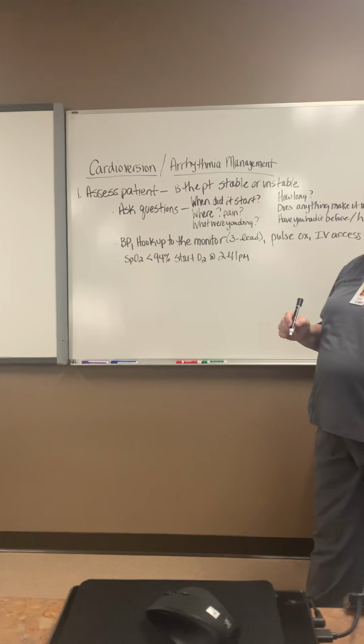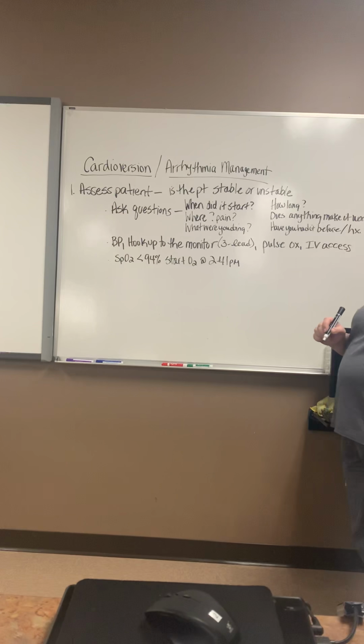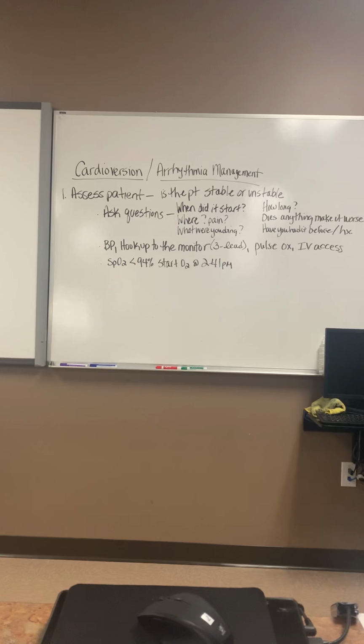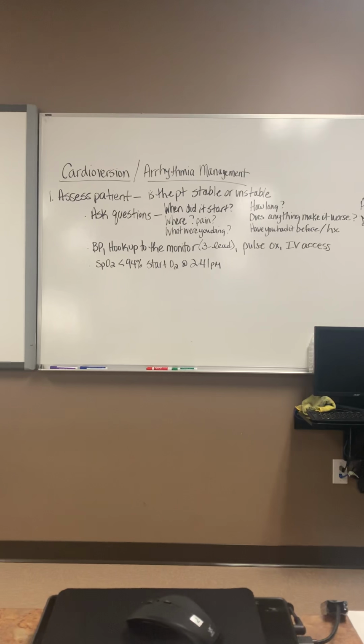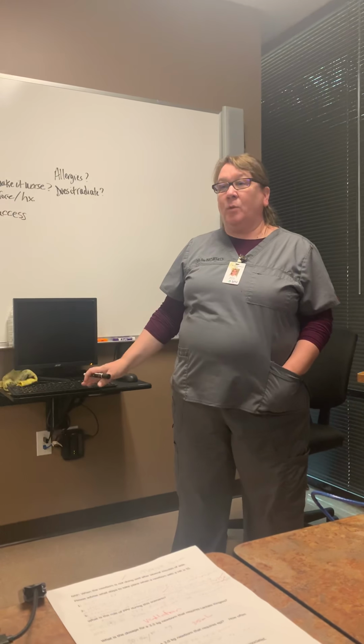Will you have your Ambu bag ready? Why do I need an Ambu bag? Just in case. No, that's going to be with our crash cart, which we're going to assume is nearby. So that's our just in case. We don't need to have an Ambu bag. We only use oxygen now if the SATs are less than 94.